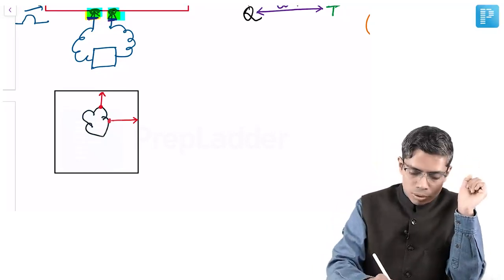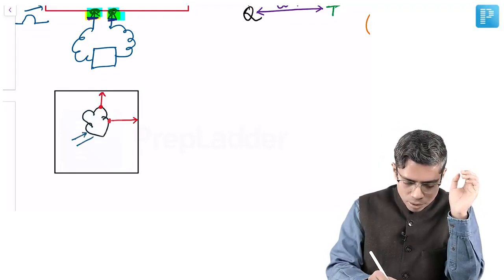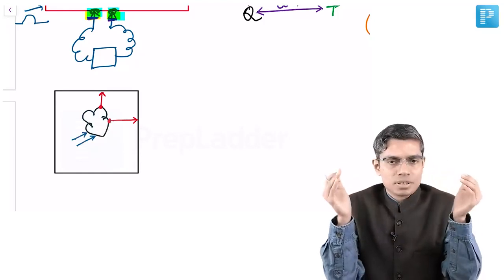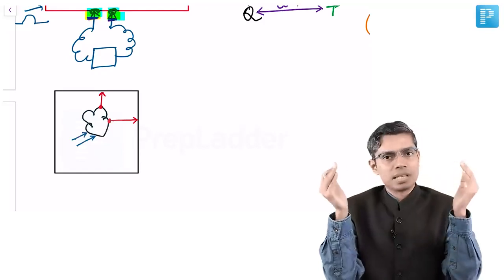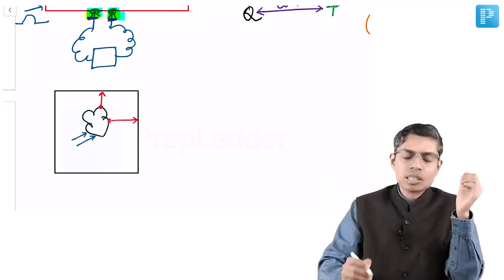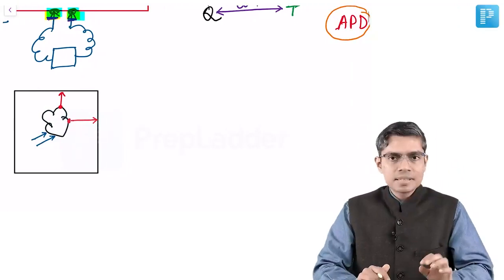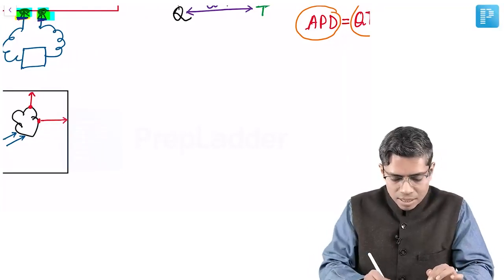That's why, although we are discussing this as if we have placed 2 electrodes on the surface of the heart, the actual ECG does not place electrodes on the surface of the heart, rather we place electrodes on the surface of the skin. But it will make no difference, because the human body is a very good conductor of electricity, right? Next, there is another point about surface recording. That is not actually a problem, but another understanding.